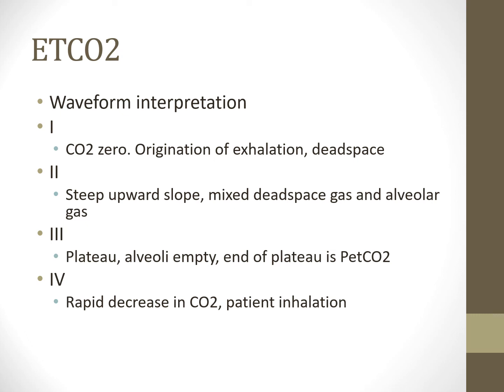As the patient further exhales, you're going to see the waveform start to go up. So now we've got more dead space going on. So now we're in the segmental, subsegmental bronchi, right? We have some more of that CO2 mixed gas that's coming out. Phase 3 is where we see the plateau or the alveolar phase. Very important that phase 3 is flat. It's very important that it's plateaued.